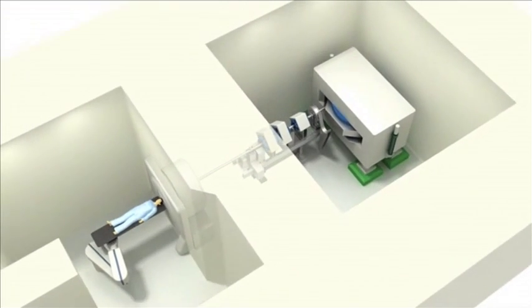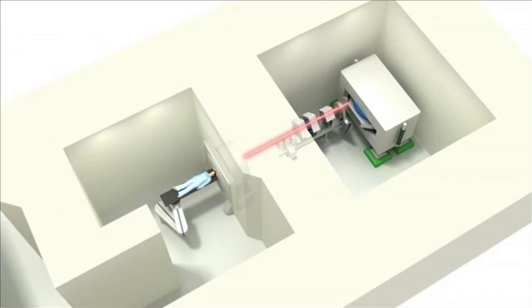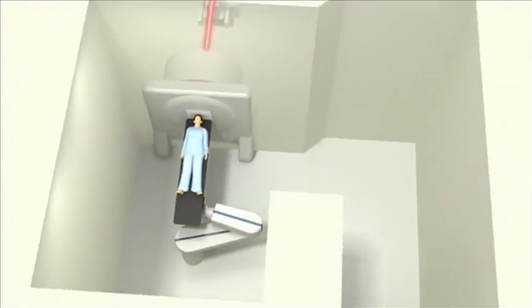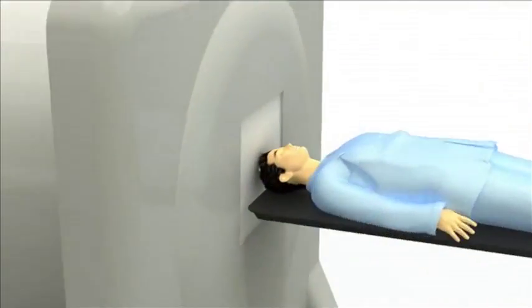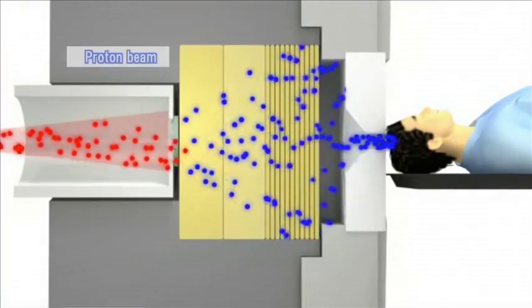The accelerated proton beam is transported to the neutron irradiation treatment section. Then the transported proton beam is irradiated onto the beryllium target to produce neutrons.